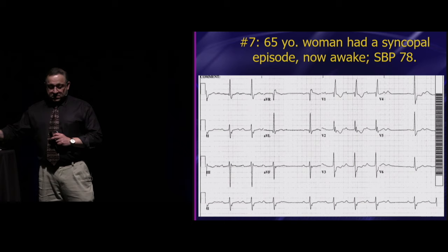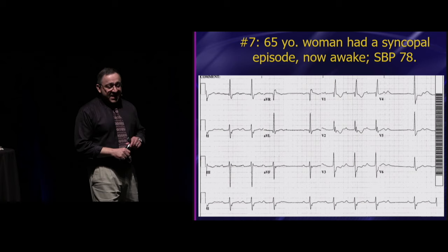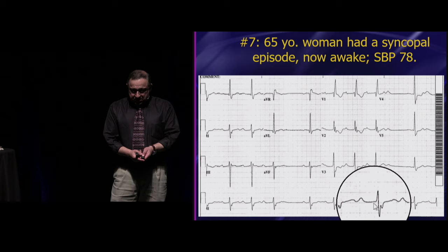So is there P wave activity? First question. Yes. All right, so Mobitz 1, Mobitz 2, or third degree, your answer lies in just looking at the PRs. What's going on in the PRs? So let's see, starting over here, there's a PR and it looks maybe a little bit longer, close, longer, and yeah, that's a Mobitz 1.